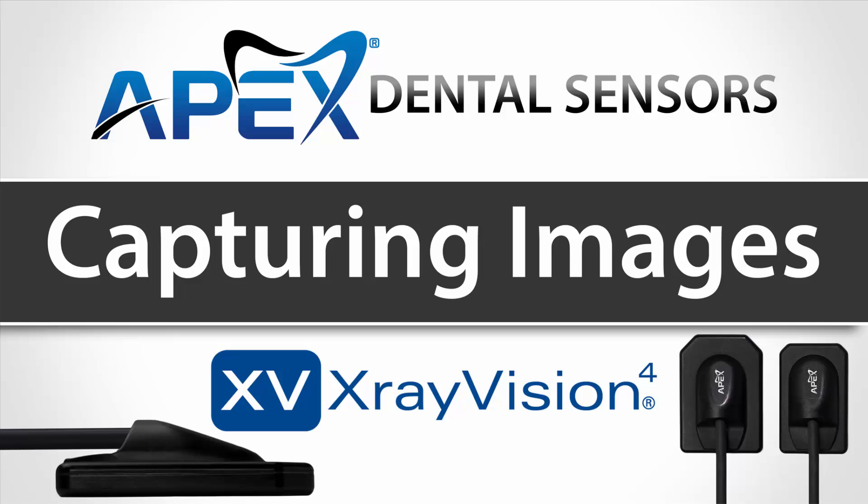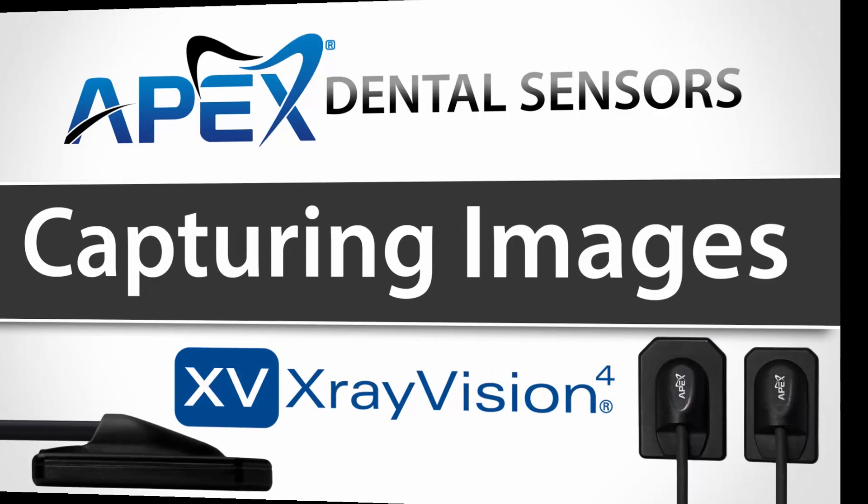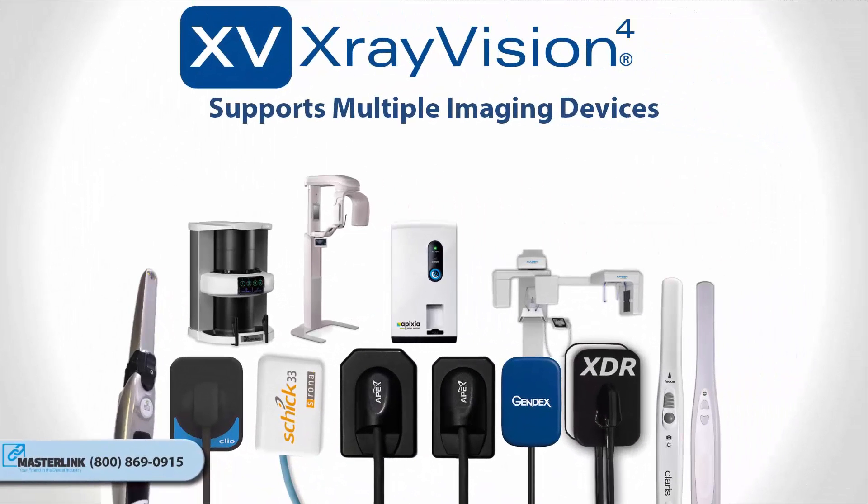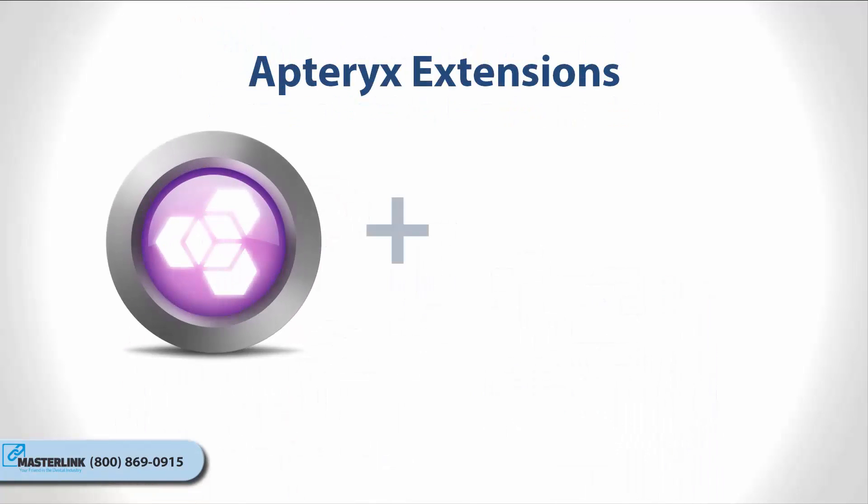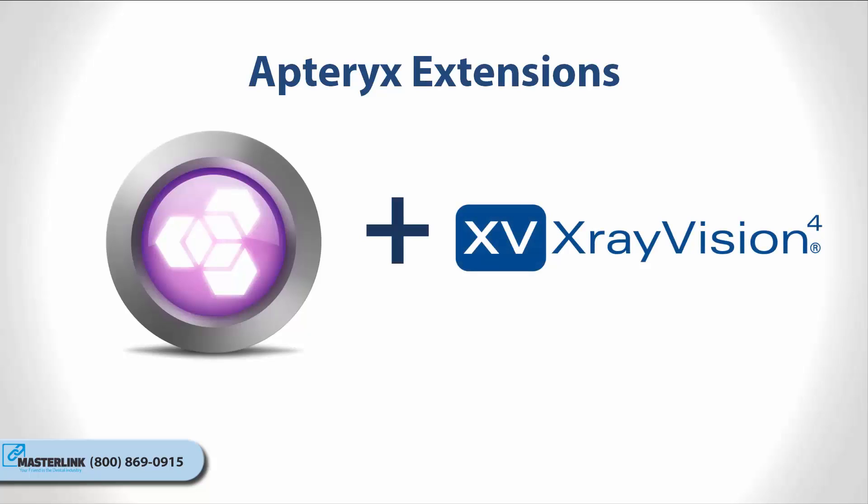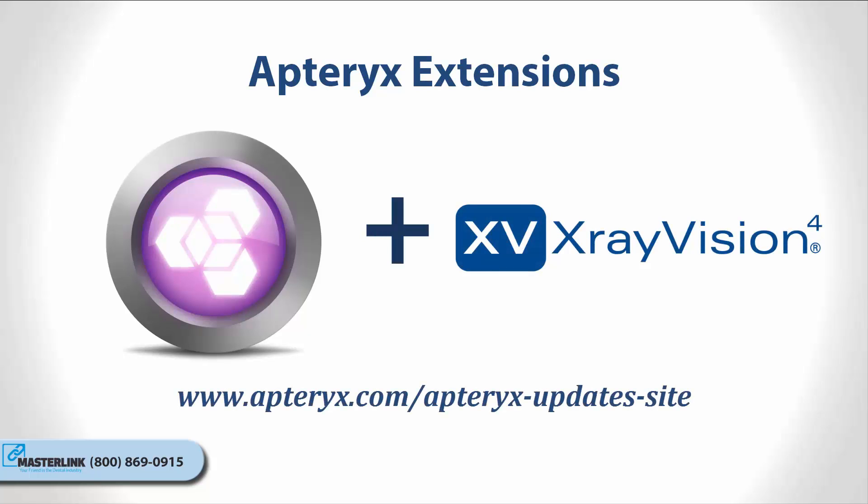Capturing Images in X-Ray Vision. X-Ray Vision supports image acquisition from a multitude of hardware manufacturers in the dental industry. Many imaging devices use Apteryx extensions to communicate with the software. These extensions can be downloaded from our updates website at www.apteryx.com/apteryx-updates-site under the Imaging Devices heading.